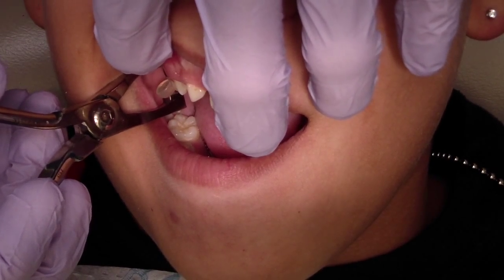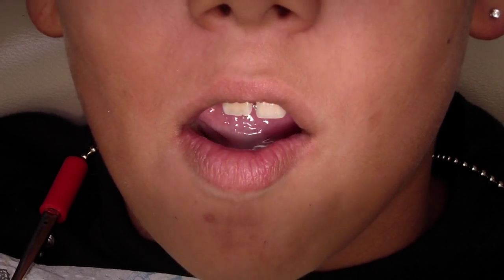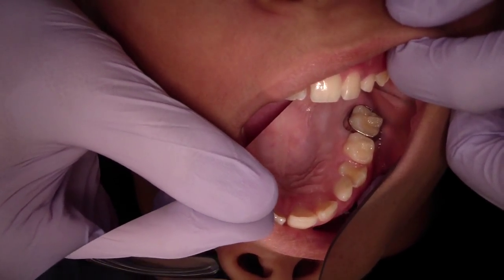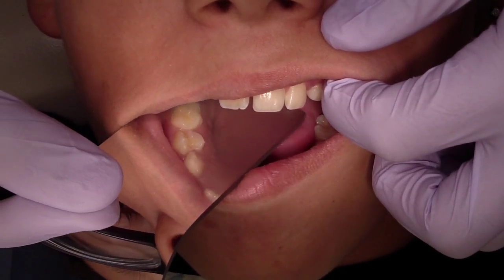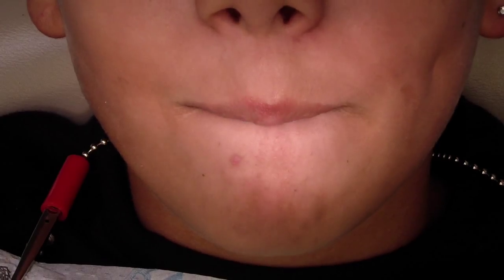I've got time — and that's my dental assistant. So that's seated. Just open big for me there, young man. Thank you. You can see the band on one side and the band on the other. Now we're going to take an alginate impression and I'll show you how we manage that in the lab afterwards.